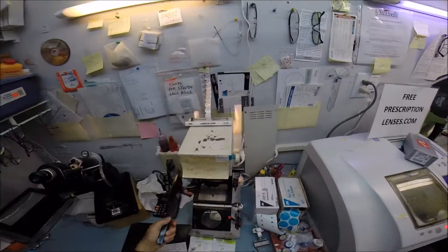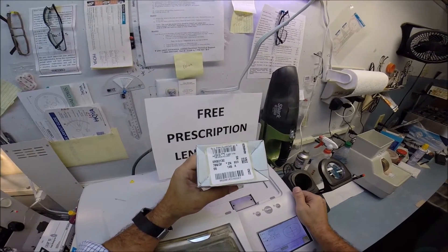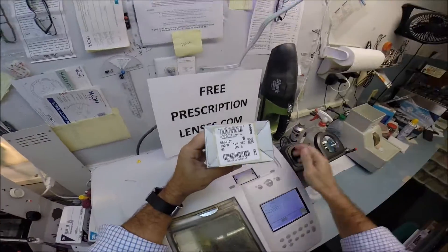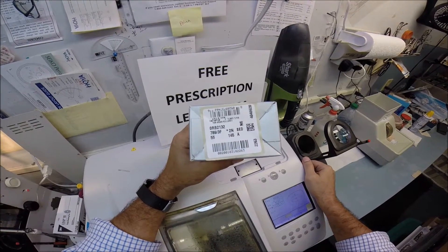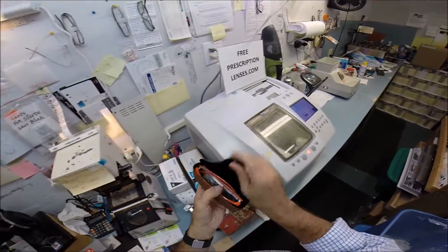Hey Alex in Toronto, Canada. Matthew here with FreePrescriptionLenses.com, and with the help of my GoPro camera, I'm going to show you how I cut prescription lenses for your Ray-Ban 2132 New Wayfarer, color 789 in the 55 eye size. And of course the color 789 is the blue-orange.